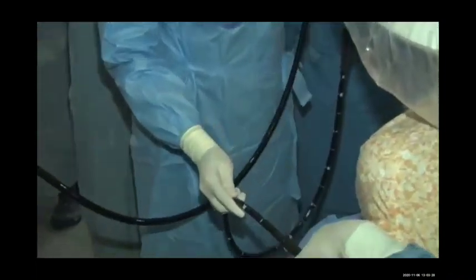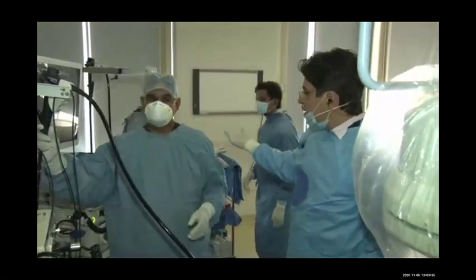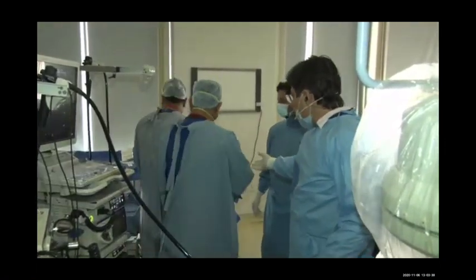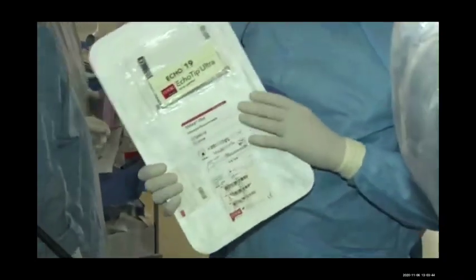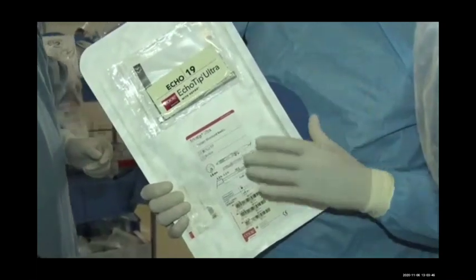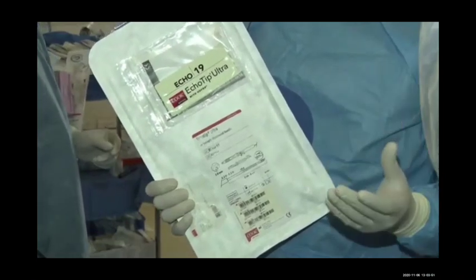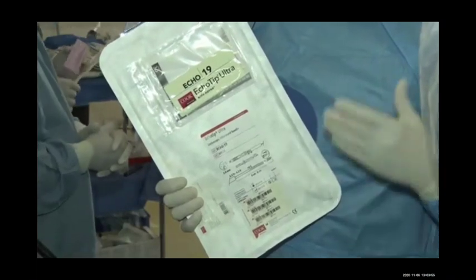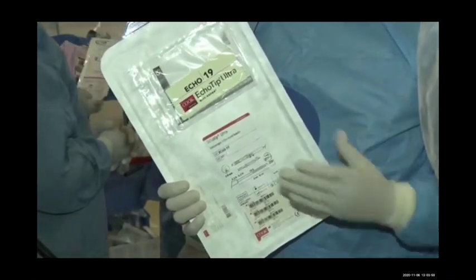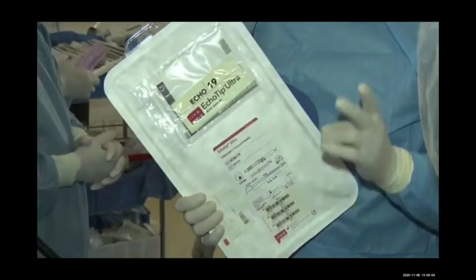EUS now. And before that, I just wanted to show the accessories which are required. So Ashwini, can you show me the accessories that are important? So we have various sizes of the coils available. So first I will use the 19G needle. It will depend, you can use the 22G needle also. If the diameter of the coil is less than 10 millimeter, then you can use a 22G needle. If the diameter of the coil is more than 10 millimeter, then you should always use a 19G needle. I keep at least around 2 needles with me in case the needle gets blocked.